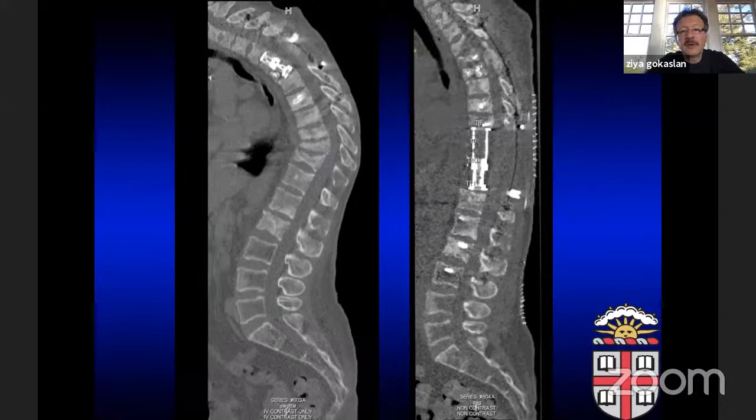These are very powerful techniques. When you resect the spinal column, you can really put it anywhere you like. Controlling the spine becomes a bit of an issue. We use temporary rods for that. And typically it takes 2 surgeons, one deploying the cage anteriorly, another one controlling the posterior elements or the rods posteriorly, loosening the nuts as the distraction is applied across.